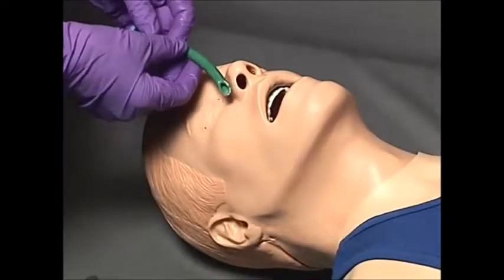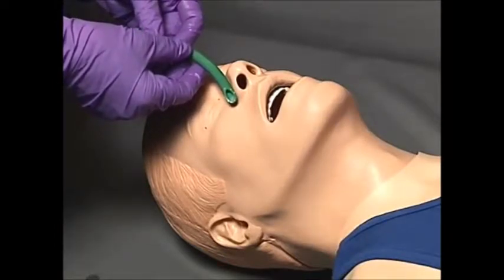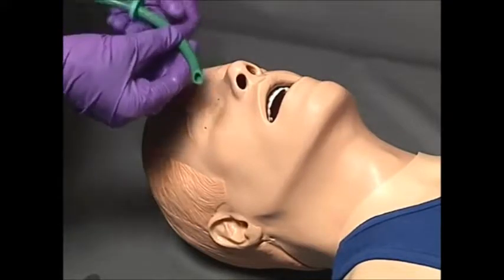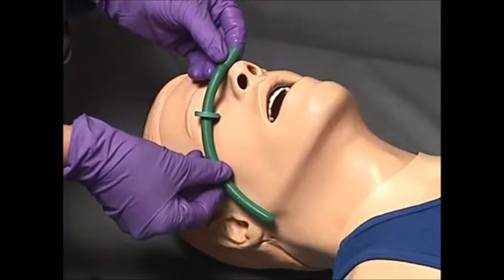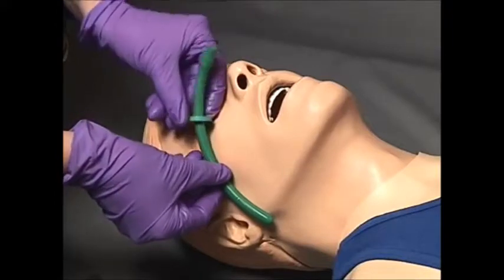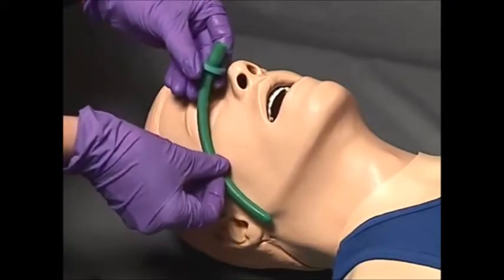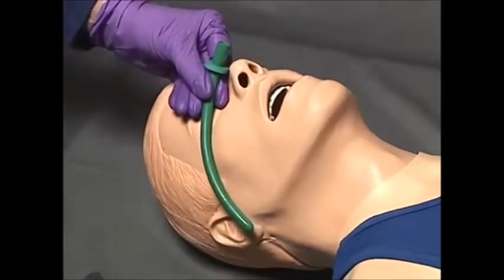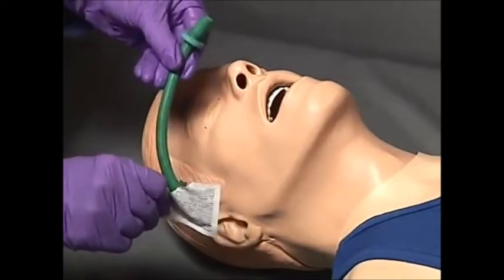To select the correct size nasal airway, begin by visualizing the patient's nares and select a nasal airway with a diameter slightly smaller than the patient's largest nare. Once the diameter is determined, then measure the device from the tip of the patient's nose to the tip of the earlobe or angle of the jaw. The rubber washer or grommet can be slid back and forth on the device to ensure a proper fit. Lubricate the distal surface of the airway with water or a water-soluble lubricant.